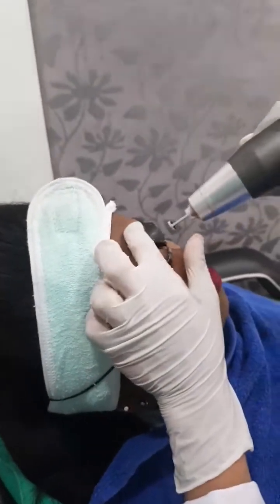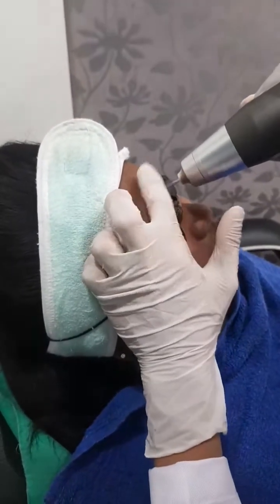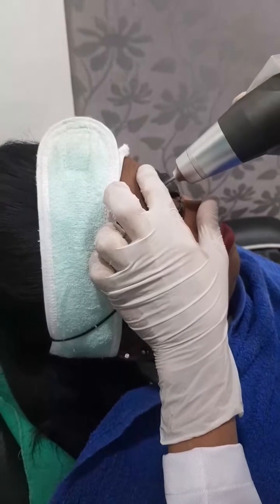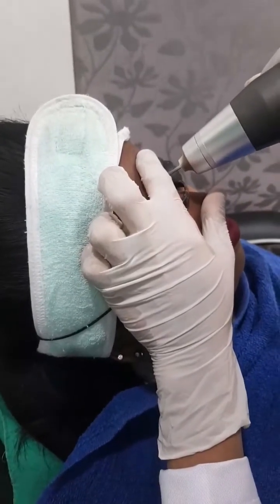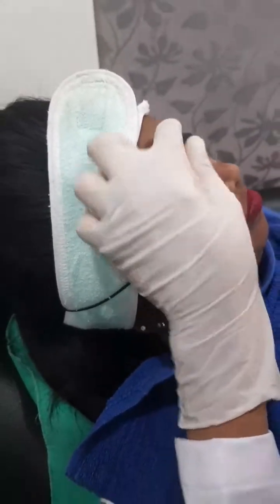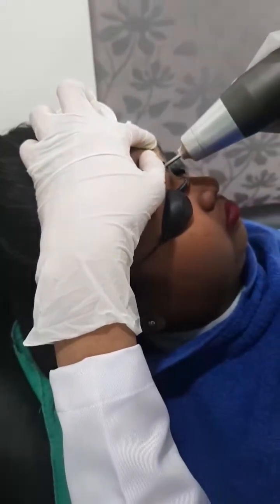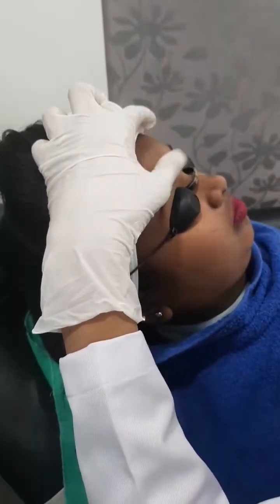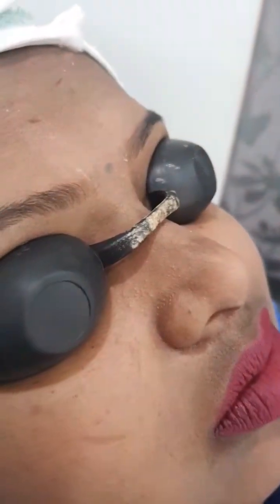So, ready. Just feel a little sensation — don't worry, you will just feel a tapping sensation. Okay, relax. So this is just slightly — we have done it.